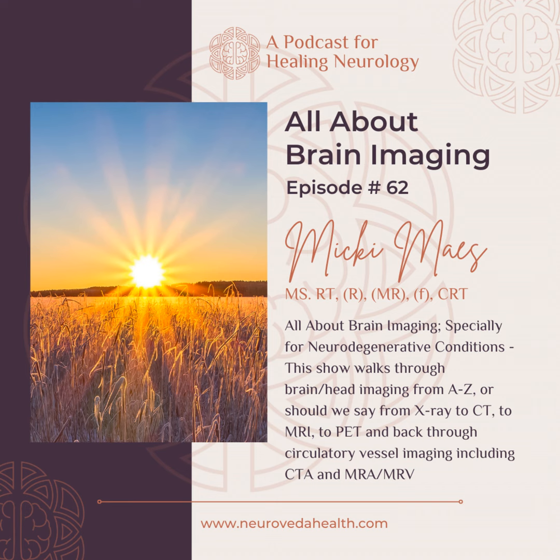So it'll show aneurysms, strokes, and any changes to the arteries. Now, MRI is going to show the same basic thing, maybe with a little better detail. You can see small plaques and little stenosis areas, and deep vein thrombosis if you're looking at veins instead of arteries. So with MRI, you can do the magnetic resonance angiogram and a magnetic resonance venogram.